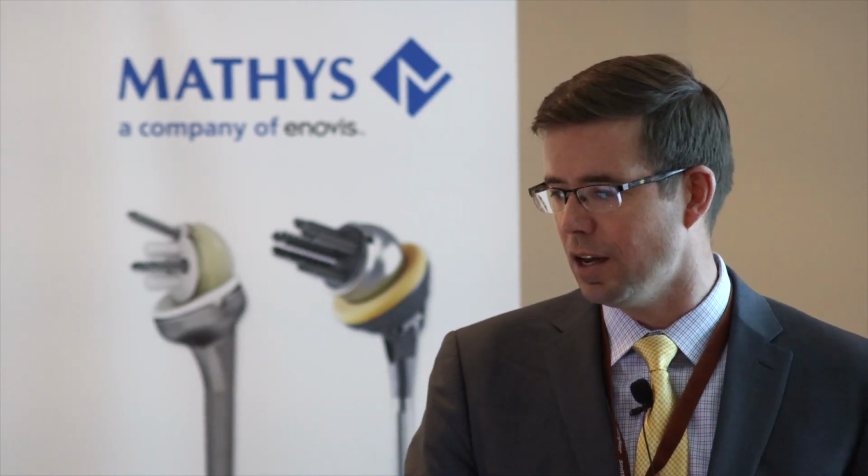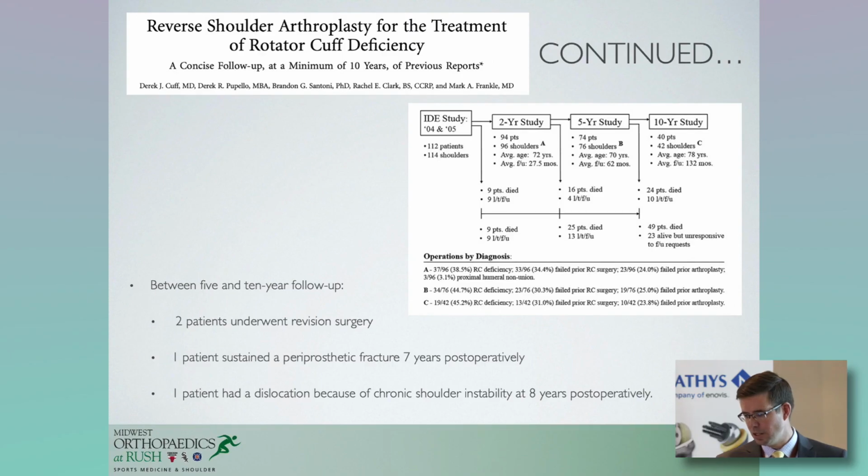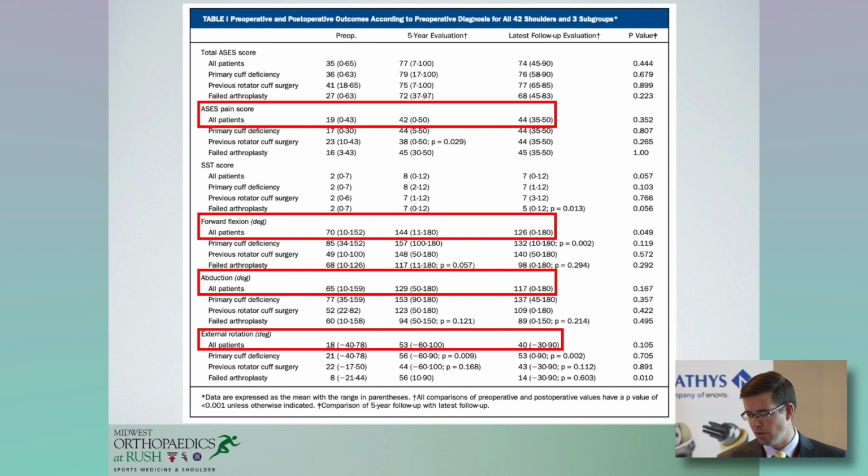That is incredible data. Obviously we'd like to know even further beyond 10 years, but as far as what we have in our field of orthopedics, 10-year data is something we need to take seriously. There's a periprosthetic fracture and a dislocation, but basically the patients did very well.